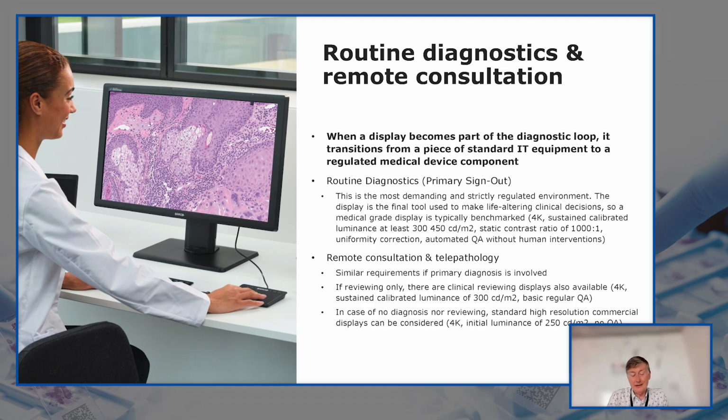So making the choice for a medical grade display does make a lot of sense. That's primary diagnostics. For remote consultation and telepathology, that also makes a lot of sense. For a medical grade display, maybe with a little bit lower specs, where you say, I still want to have 8MP with 300, etc. But also still there, you're reviewing images, which are quite important. Only in a case where you don't do any diagnosis, no reviewing, standard office displays could be used.